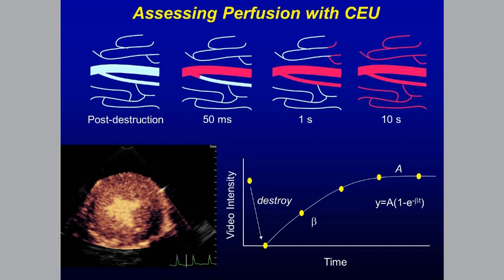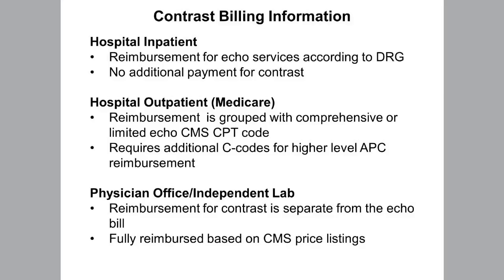However, I am a little bit cautious personally in doing this just because of the potential for biological risk. I've been in the field for quite some time, and we have a variety of people injecting. Sometimes we use our fellows, sometimes various other people, because our sonographers are not currently allowed to inject. And so you tend to grab anybody, and if somebody hasn't quite hooked up that Luer lock perfectly, you have that potential for splash. Although it does work really well, I think there's some risk with that that maybe is not necessary.